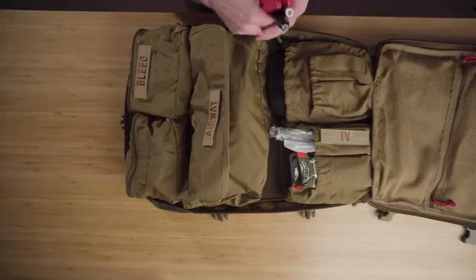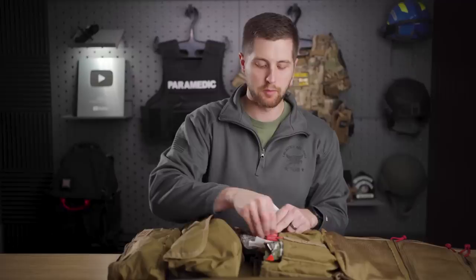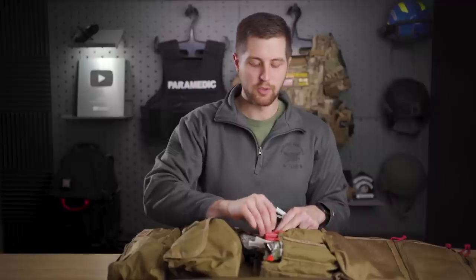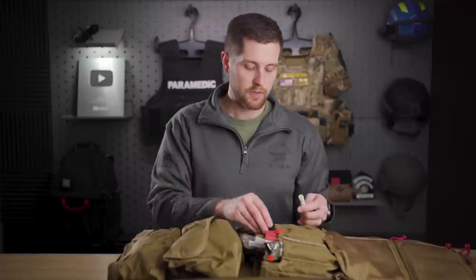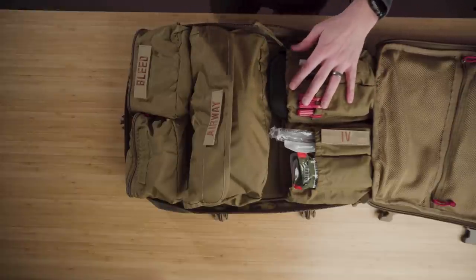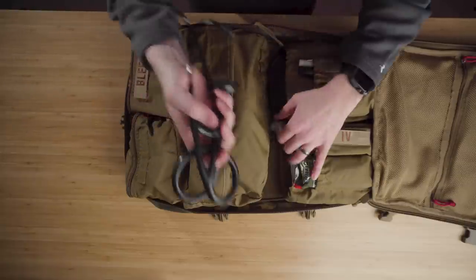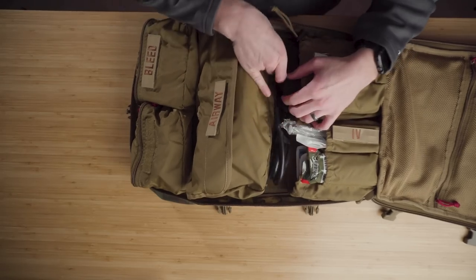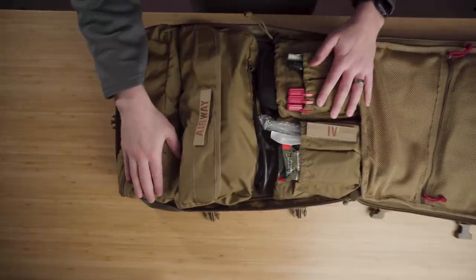In the extra pockets I'm throwing in three decompression needles — probably slight overkill, but they take up no space. They can also be used for needle crikes in a rescue situation or for a pediatric patient. I've also got a Sharpie and a penlight that go along with the diagnostics. And lastly a stethoscope — there's no great place for it in these kits, but I'll wedge it in with the diagnostic equipment.